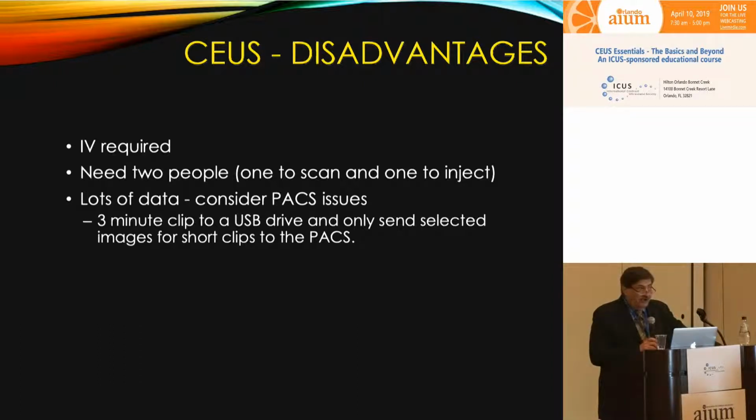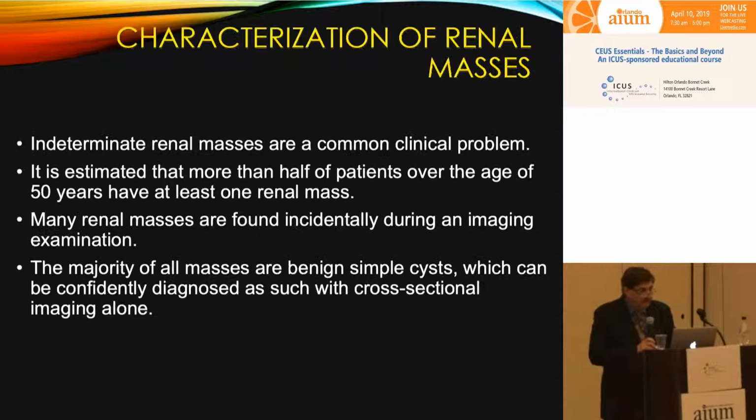I also mentioned that if you wanted to save larger data information for either reviewing or for research, you can buy a 4 terabyte USB drive and plug it into the ultrasound machine and store all your images there, so that you can retrieve them and then go over them again.